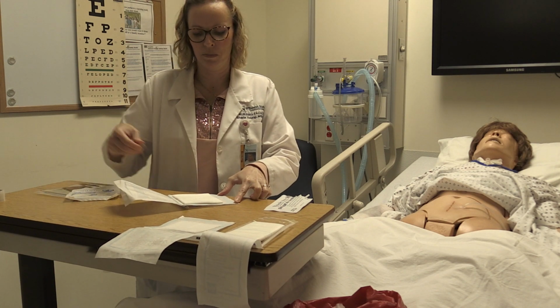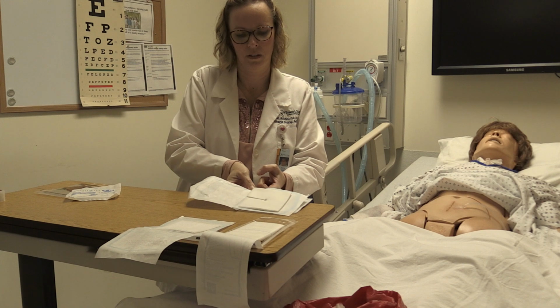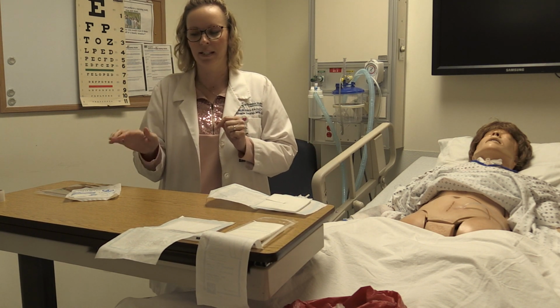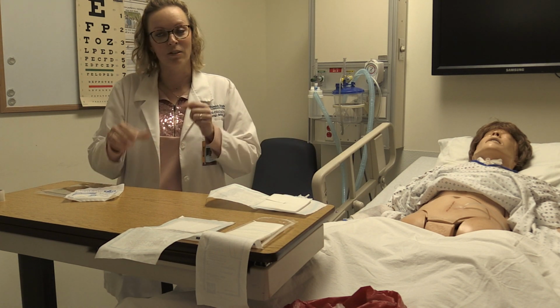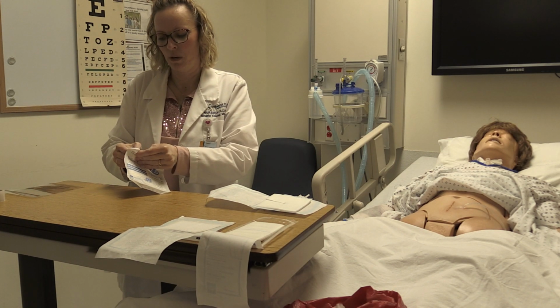Only touching the 1-inch border. And then I'm going to position it over my swab sticks, and then I'll be able to take my sterile gloves and touch the middle of the package. Sterile to sterile, that is legal. Now I'm going to open up my gloves.